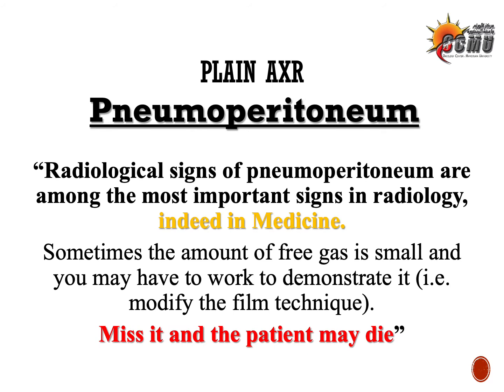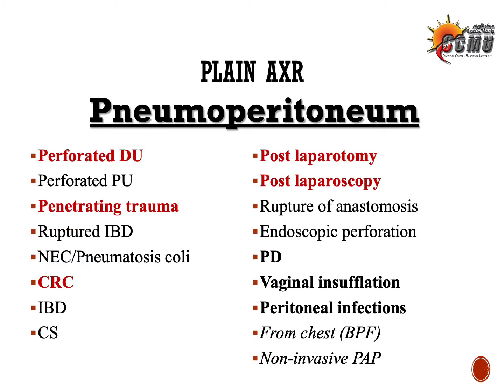It's actually one of the most important signs in radiology and in medicine. If you missed it, the patient may die. So it's very important that if you're examining a patient with a perforated viscus, you must concentrate on finding signs of pneumoperitoneum.